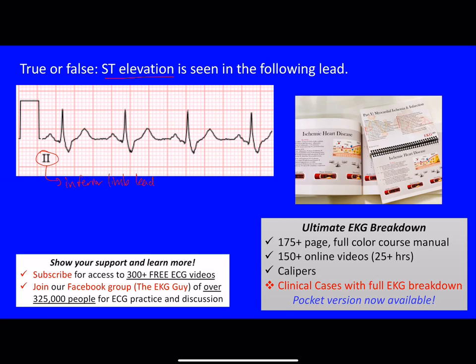Just to review, here are our complexes. We'll draw out the P wave — you can see the P wave here. This is our QRS complex, which represents ventricular depolarization. This is an R wave and an S wave, so we call this a QRS or more specifically an RS complex. This is the ST segment, and then we have the T wave. We also have the PR segment here, and this portion is our PR interval.